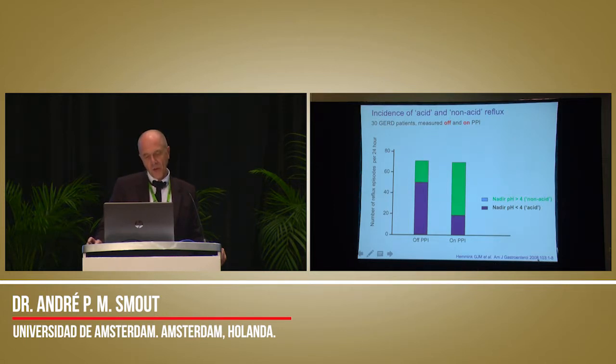researcher in our group, almost 10 years ago now, studied 30 GERD patients off PPI one day and on another day, in randomized order with a washout period in between. And as you can see, the total number of reflux episodes measured with impedance, so that's all sorts of reflux, acid and non-acid together, is not diminished by giving a patient a PPI, but on PPI, most of the reflux episodes are non-acid, with a pH above 4.